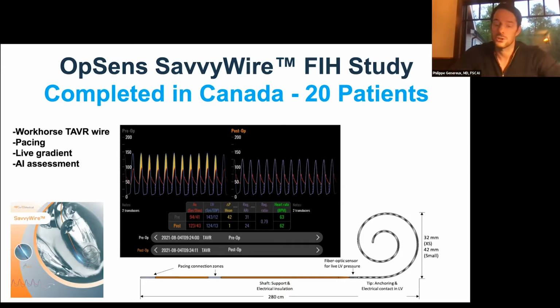also take the gradient. So the work that we did with the 014 wire was not only to prove that we can use this to assess the AS, but also as a first step to validate the algorithm, which will also be validated in the Canadian study that will be presented actually at EuroPCR in a couple of days by Joseph Rodescabo. So I'm going to stop here and happy to discuss and entertain questions.